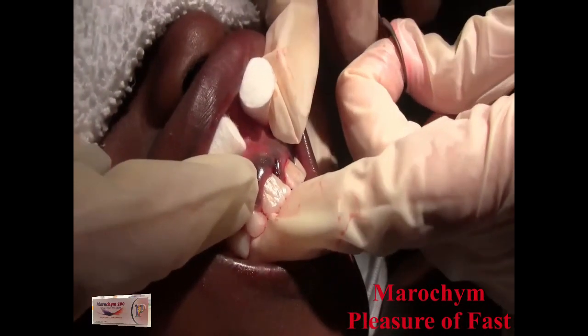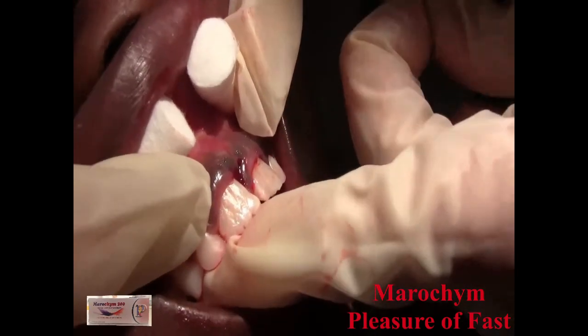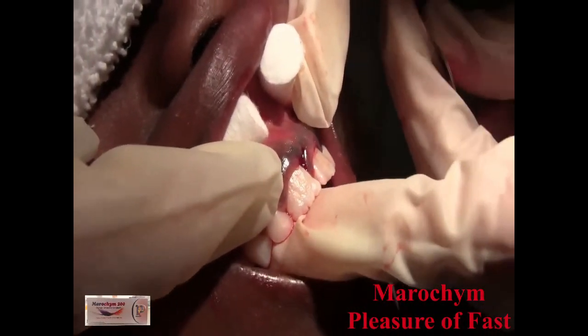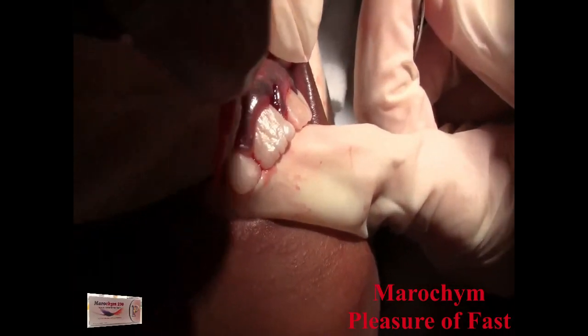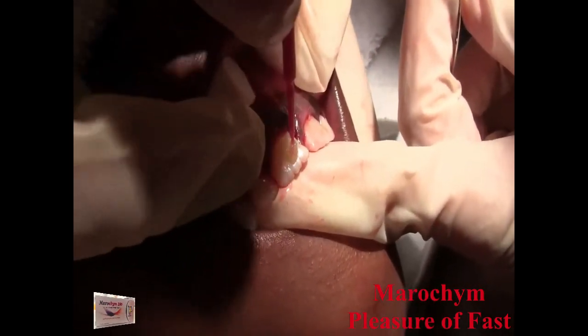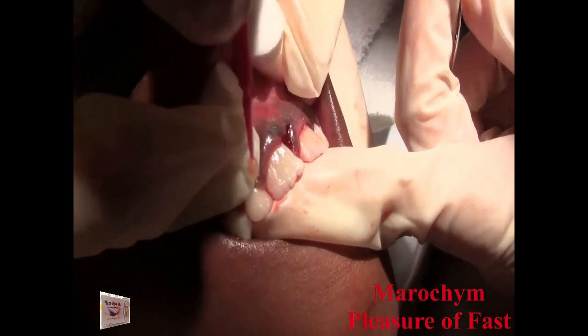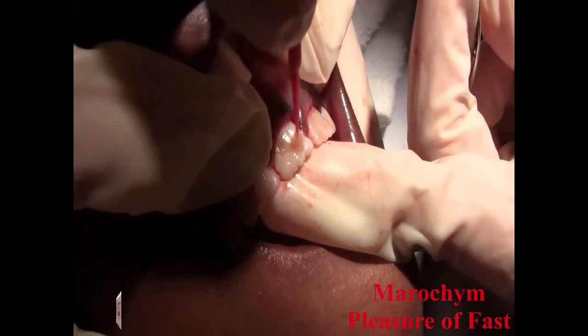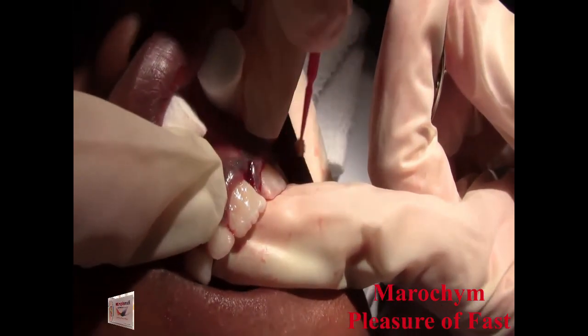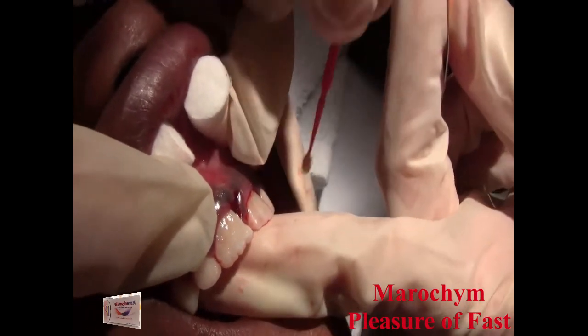This is our little prime and bond in one. It's an etch prime and bond, but now keep in mind, you want to really use this and keep it as dry. Open a little bit bigger for me. There you go, because we're trying to keep those teeth dry back there. I know this is difficult.